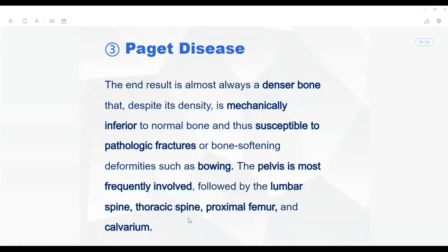However, in a clinical setup, even though the pelvis is frequently involved, what we actually use to diagnose Paget's disease is the calvarium. Okay, calvarium means we are talking about the skull. The confirmatory diagnosis of Paget's disease is actually made from the skull, where we see skip lesions. Two diseases particularly cause skip lesions inside the skull. One is multiple myeloma.